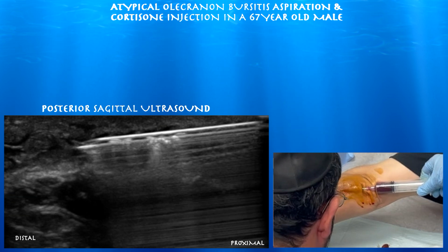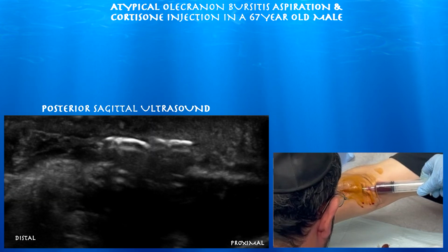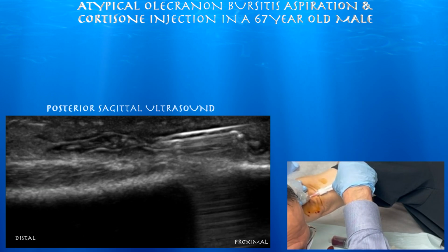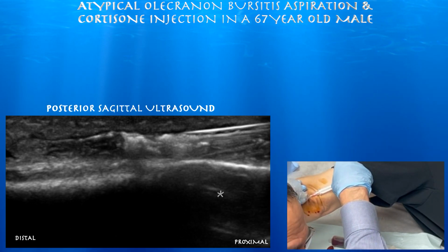Here you can see we're draining just about all of this serosanguinous fluid out of this atypical olecranon bursitis. Here we're doing the cortisone injection after the aspiration. And you can also appreciate a pretty good reverberation artifact underneath the needle.